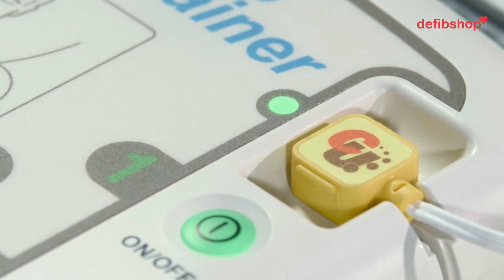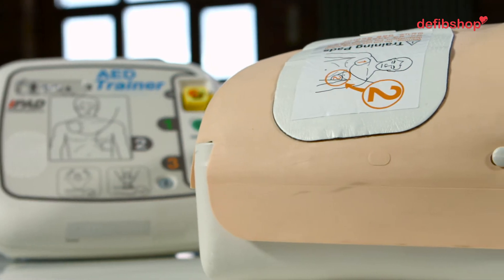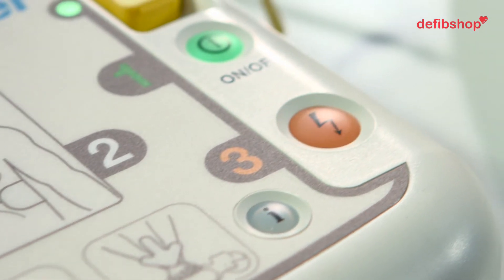This is a semi-automatic defibrillator, which means that the shock is delivered by the user. Once the victim has been analysed and if a shock is necessary, the unit will advise the user to stand clear and press the flashing shock button.